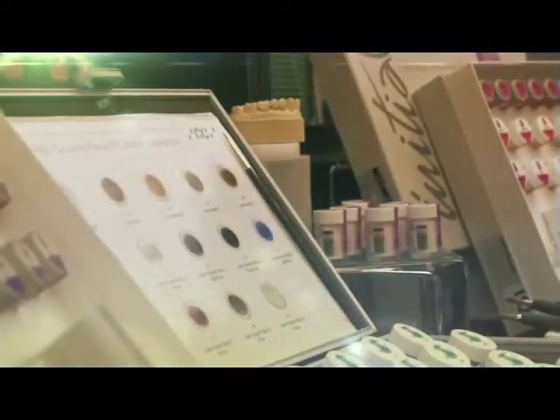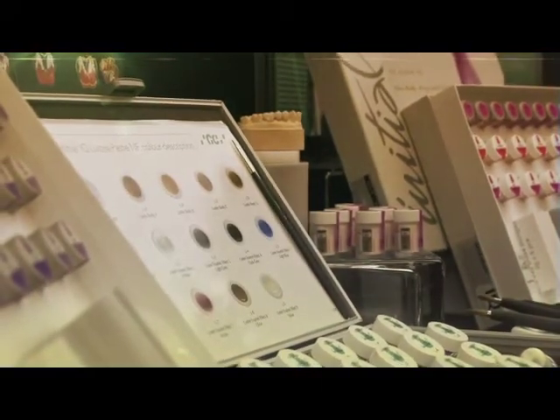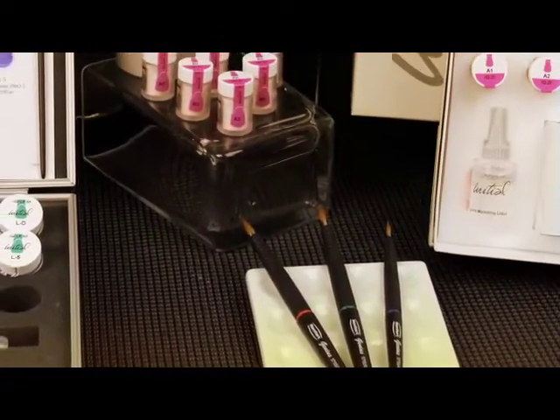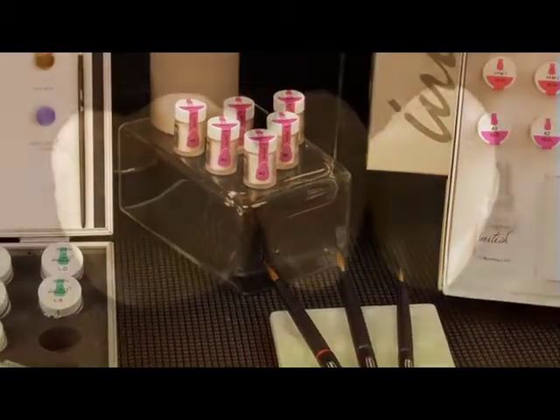GC Initial IQ family of ceramic materials were designed for you, the dental professional. In an ever-changing industry, GC America has developed revolutionary new materials to make dental laboratories more productive in less time, without compromising aesthetics.